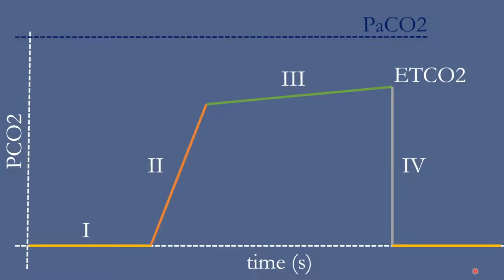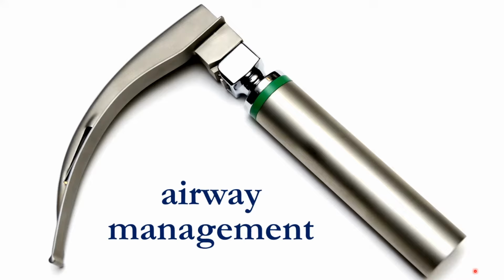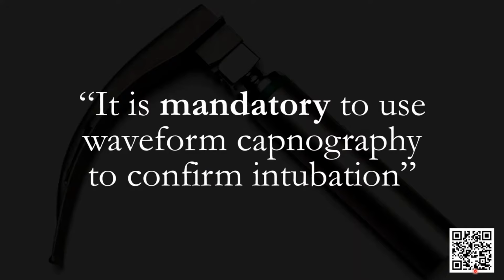So now let's talk about how we might start to use this information. One of the most obvious uses for waveform capnography is airway management. In fact, the British Journal of Anesthesia guidelines mandate the use of waveform capnography to confirm intubation. You'll find that we've done this to some extent during the COVID pandemic, but prior to that, we were using more colorimetric capnography, which is different, and I will say not only different, but inferior.